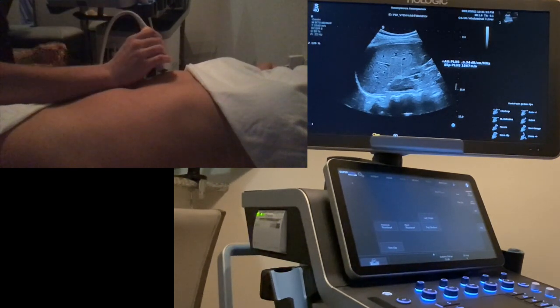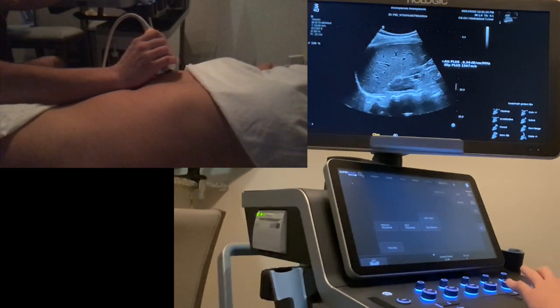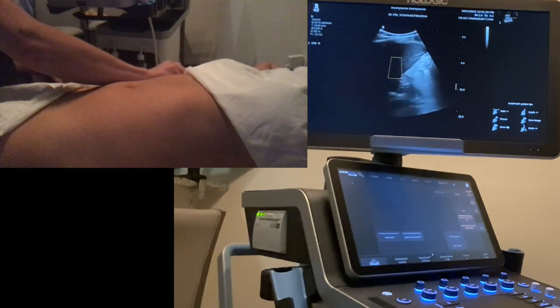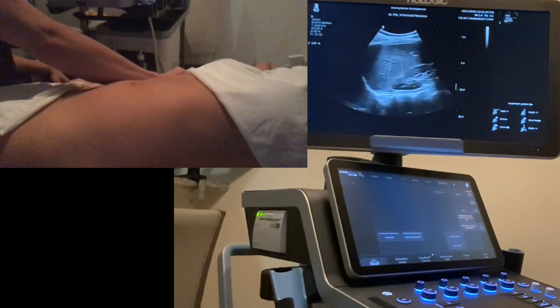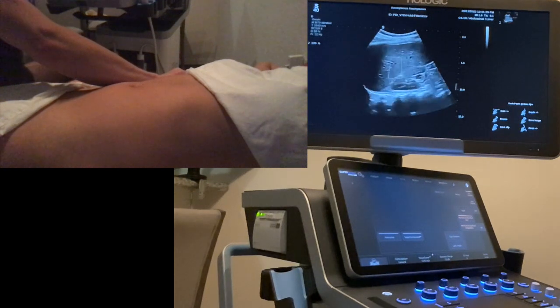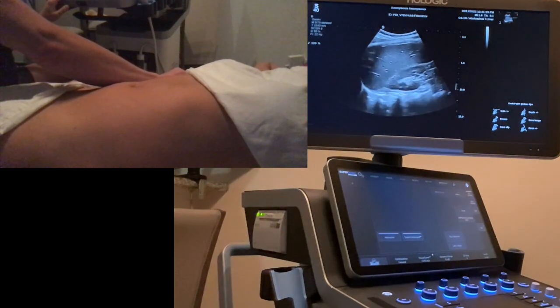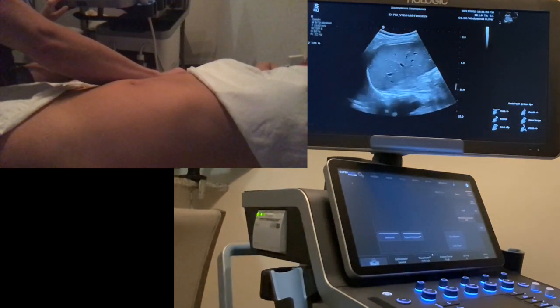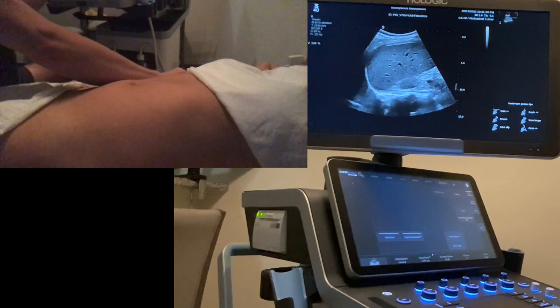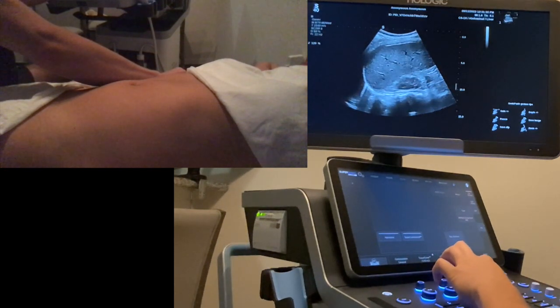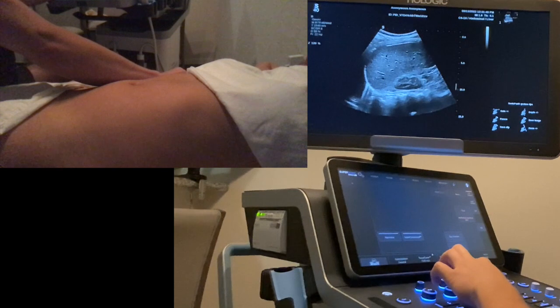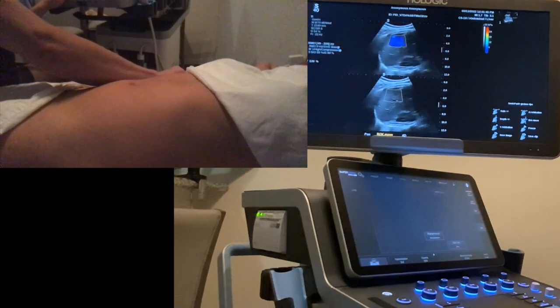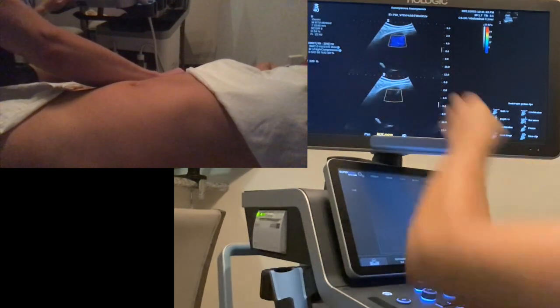I'm going to save that image, which puts that number into the reporting package. I'll unfreeze — so I'm back live on the liver. I'll get rid of the ROI box for the SSP because now I'm going to go into elastography to get my kilopascal readout. I'm going to touch the SWE — Shear Wave Elastography — button.